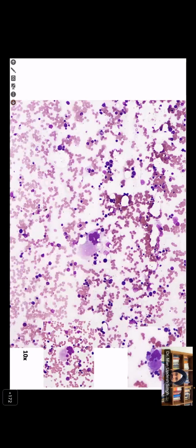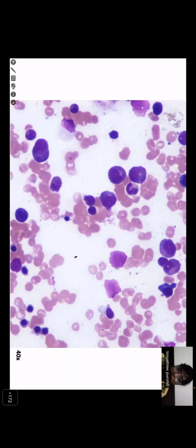It's probably a normal cellular looking marrow. The trails also show some cells there. I don't see a megakaryocyte as yet. But yes, so you see them here. Yes, sir. So enough megakaryocytes for you. Right. So we move to the next part for morphology.